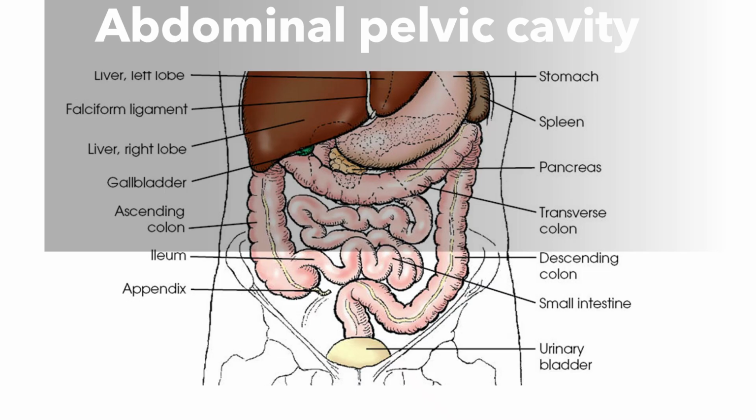Kidneys do show up on thinner habitus. Okay, so asthenic, hyposthenic, and some sthenic, you'll see kidneys. As the patient becomes larger and larger, the ability to see the kidneys reduces, and that's because the color of the kidneys on the X-ray kind of blends in with the excess adipose tissue, so it gets harder and harder to visualize the kidneys as the patient gets larger.